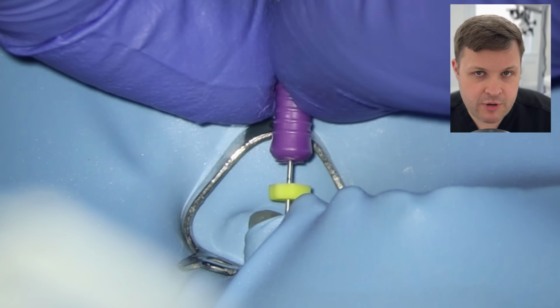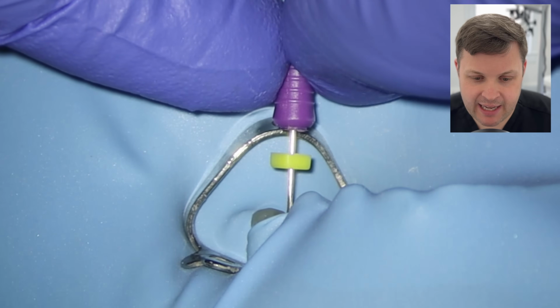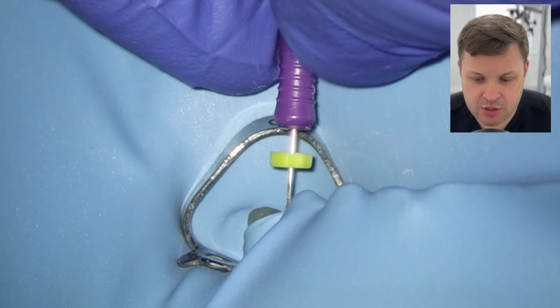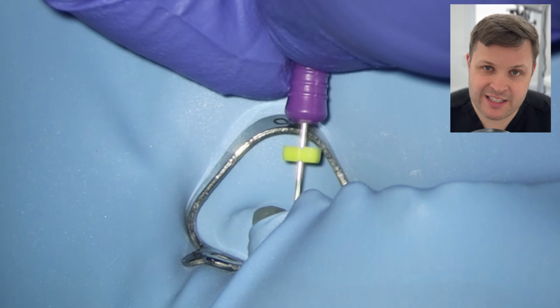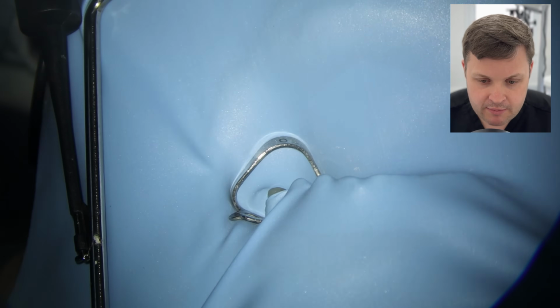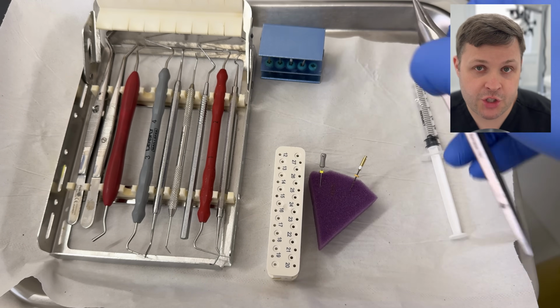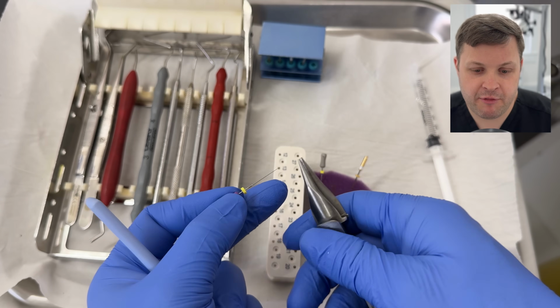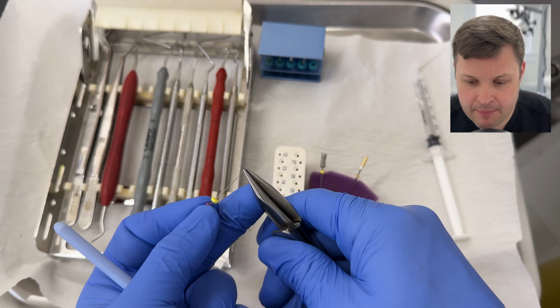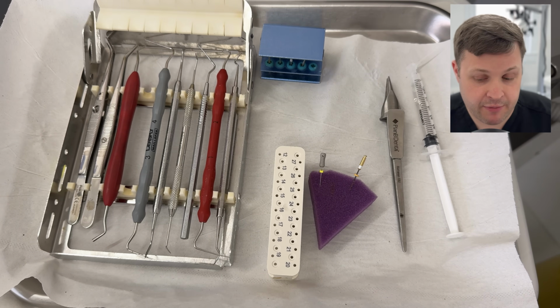Despite me trying to file out this ledge, when I pull this hand file in and out, I can see that I've still got a significant catch here, and it's getting a bit stuck. So again, the worst thing to do here is to ram the file down in there, because you're going to make this ledge or catch worse. We're going to take the hand file out and start with lots and lots of irrigation. Again, we're going to maintain the bend, make a small bend at the end, and then it's the same protocol. We're going to use that bend to negotiate around this ledge or catch.